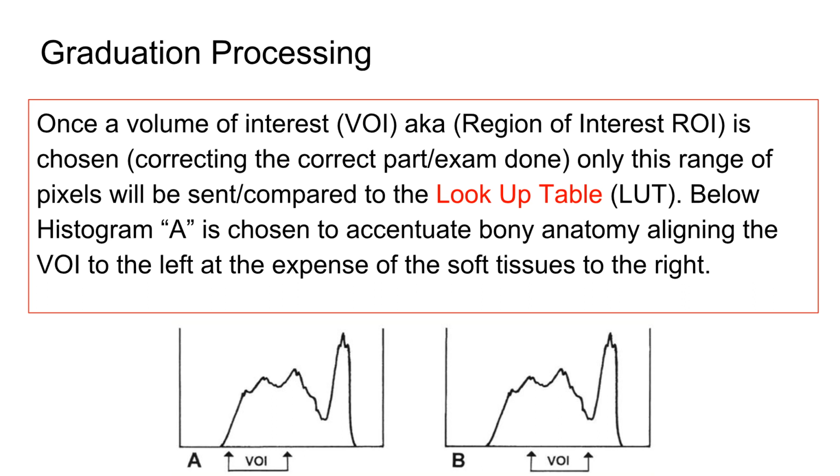A lot of times you'll see this, especially in DR, you get this gray washed out image. There's examples of this that I will continue on when I videotape myself with the rest of this lecture or give it somewhere else. Where you get that gray washed out image that kind of blinks and suddenly looks better. That image is the rescaled image.